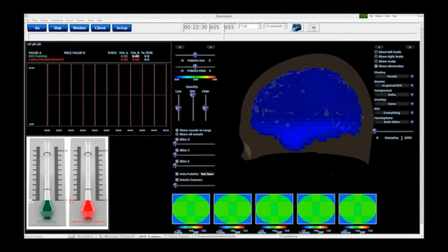That is correct, Lauren. What that network hub is covering is the power in the entire hub, all those connections going along with it. So it's not really doing a connectivity training as a network hub. It's doing the overall power of it and the Z-score tied to that overall power, or the current source density of it. Does that make sense?